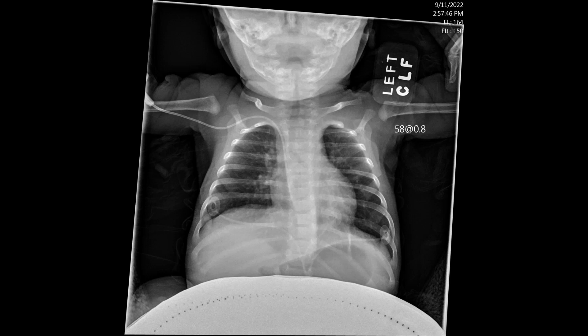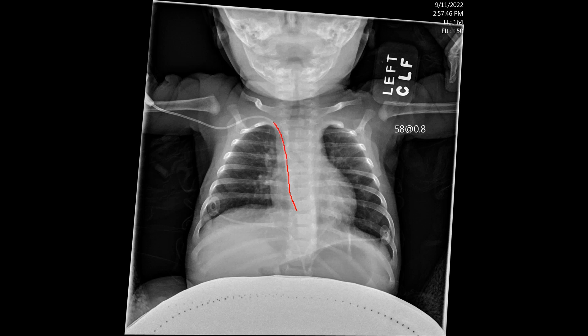Despite multiple attempts to reposition the catheter, they were unsuccessful and the patient went to interventional radiology. IR removed the pre-existing catheter and placed another catheter with a right upper extremity insertion — going through the axillary vein, the subclavian vein, into the superior vena cava. Ideal positioning is at the superior cavoatrial junction, which is about one to one and a half vertebral bodies below the carina. However, the terminus of this catheter is deep within the right atrium, possibly at the tricuspid valve or even the right ventricle — that is too deep and needs to be retracted to approximately one to two vertebral bodies below the carina.